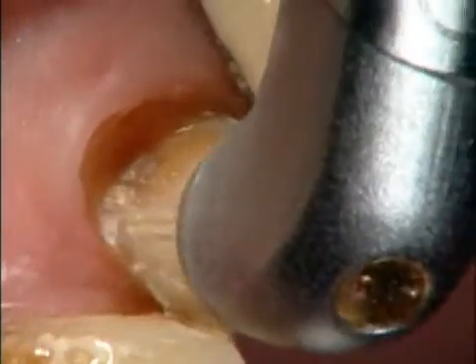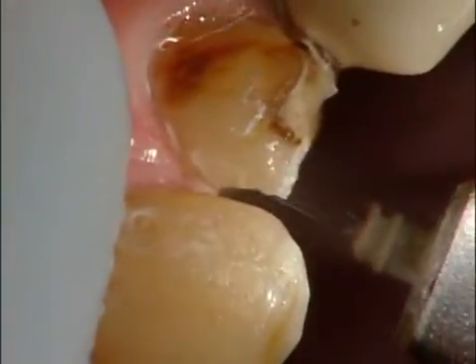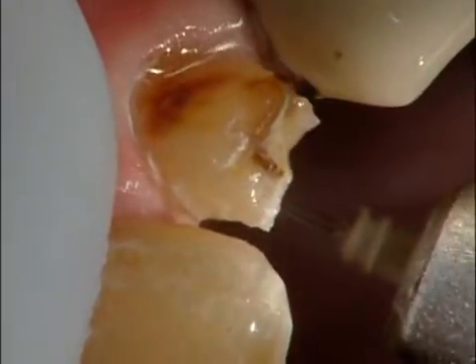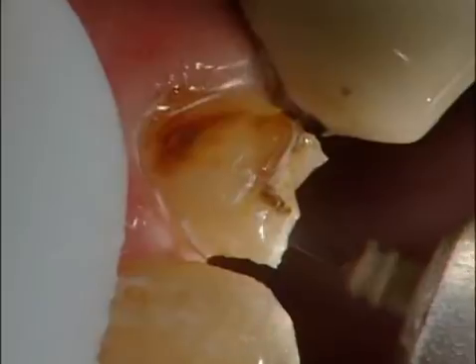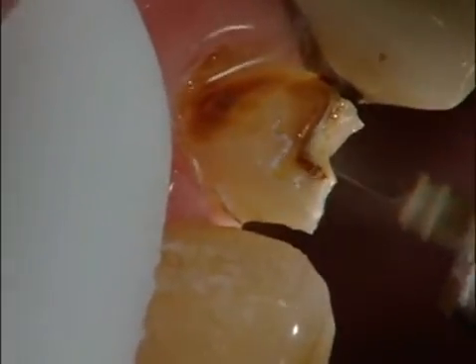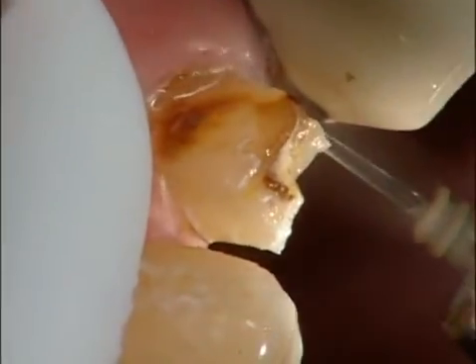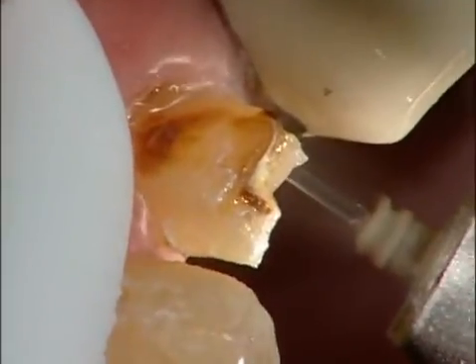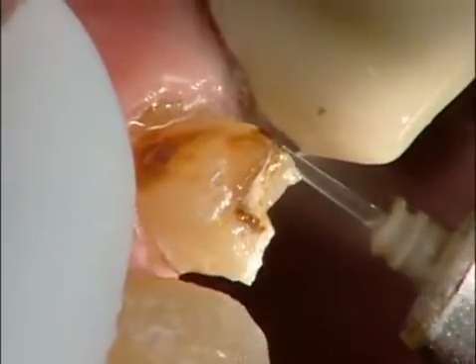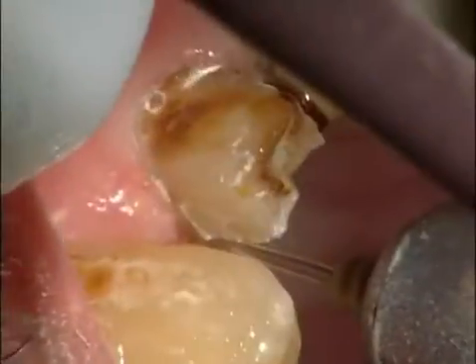One of the problems as dentists when we operate is that anytime you touch carbide or a diamond to the tooth, you cause microfractures. With the laser, there are no microfractures in the dentin. So postoperatively, my patients have very little to no discomfort whatsoever on the deepest of cavities, on the deepest of crown preps like this particular one. Obviously, the tooth was badly broken down. There was a lot of decay. Postoperatively, he had no discomfort whatsoever.